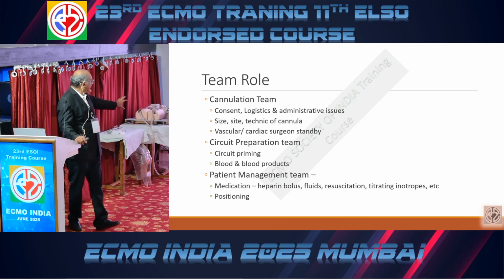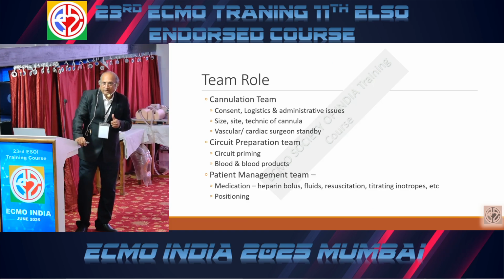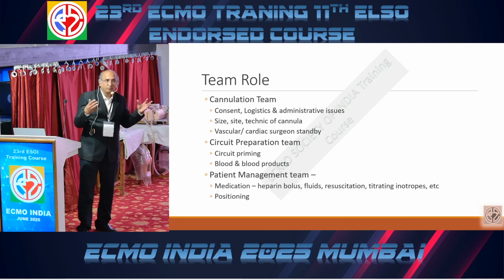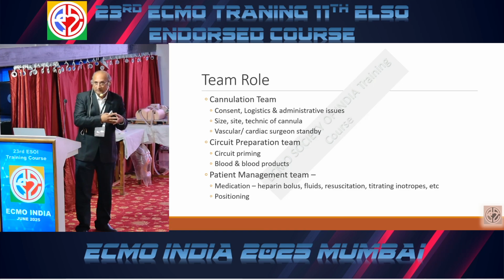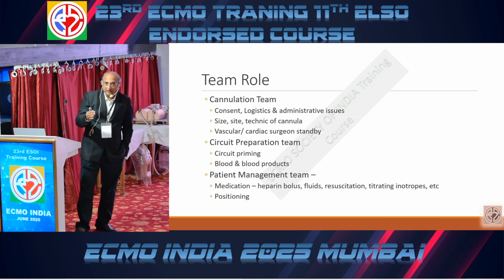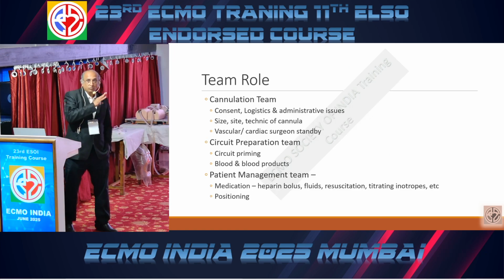And third, most important, is the patient management team. Especially if ECMO is started for the first time or is new in your center, everybody goes to the ECMO circuit and wants to see how the priming and everything is being done, forgetting the patient. You need to stabilize the patient, remember. Especially if the patient is prone, you have to supine the patient. Usually in ICU we practice a dry lung strategy, so we keep them hypovolemic. Now you require good flow, so you have to give some volume. You have to titrate the inotropes. All that has to be done to manage the patient.